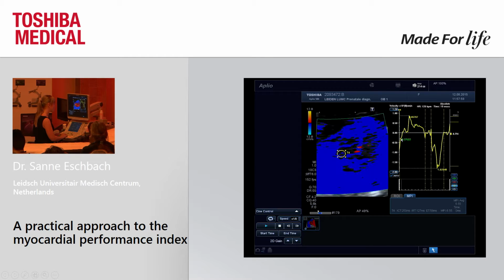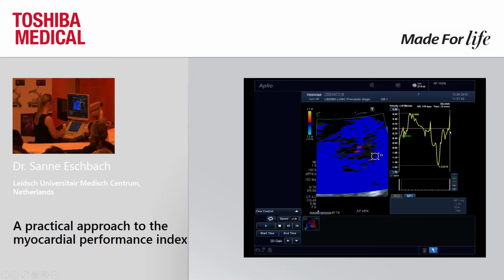It's probably about here. The left side in this case is also easy to obtain. You can see here the start, end, start, end. So this is basically the technique as I wanted to show.